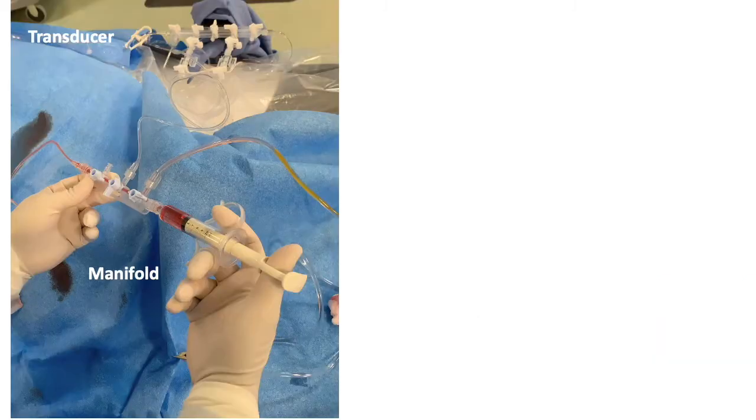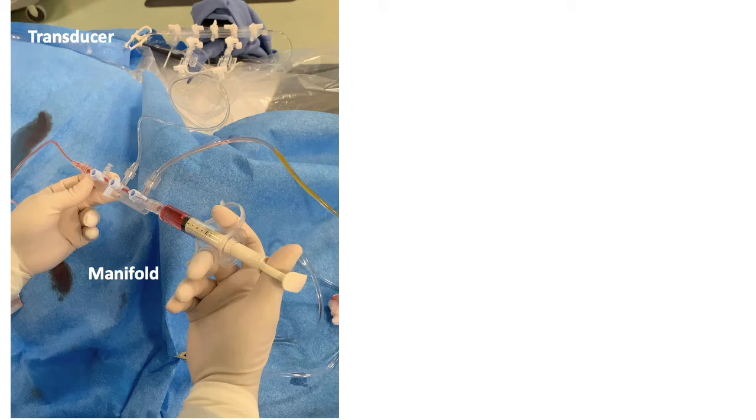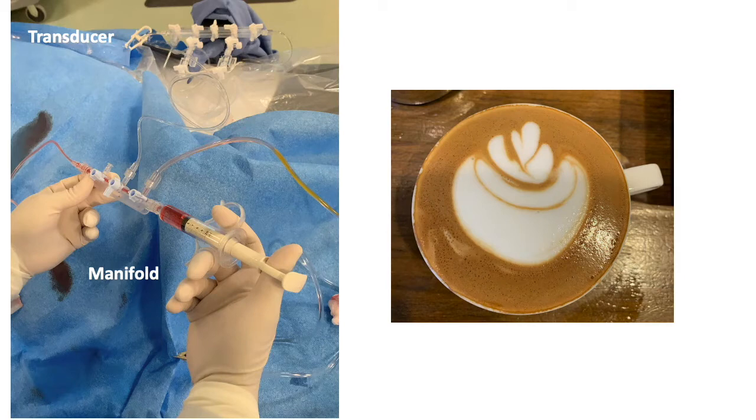A typical setup at Yale is shown here, with the manifold below connected to the transducer above. All will be revealed in this video, so sit back, have a cappuccino and enjoy.